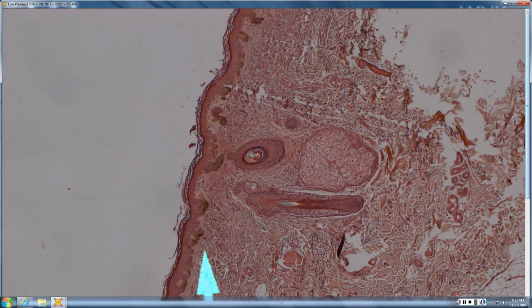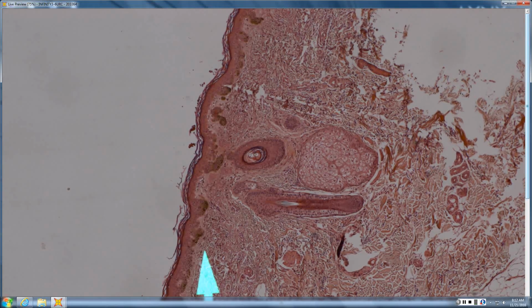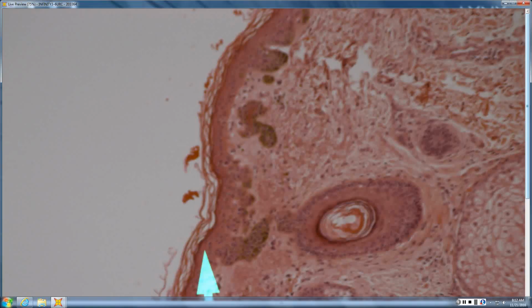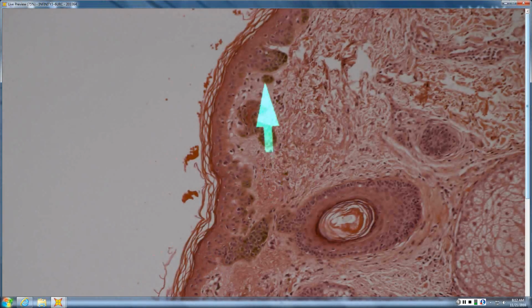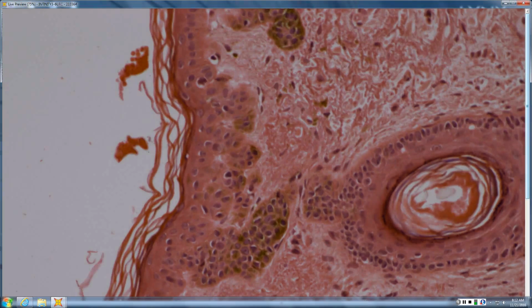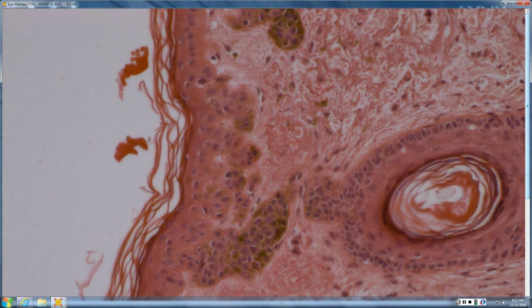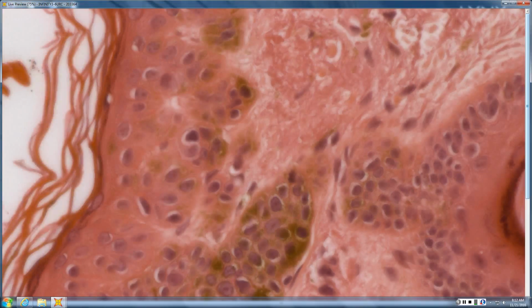So I got a dysplastic nevus. Maybe MIS, but there's a little bit of pagetoid thought. The question would be, is it keratinocyte with pigment or are they melanocytic? And are the vacuolated cells pagetoid scatter or are they keratinocytes too?